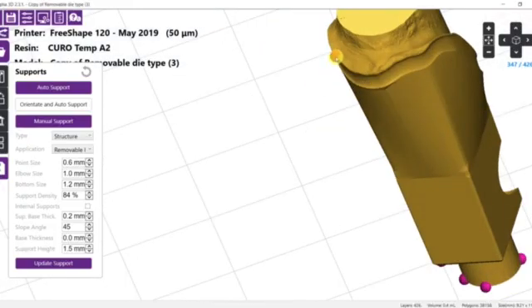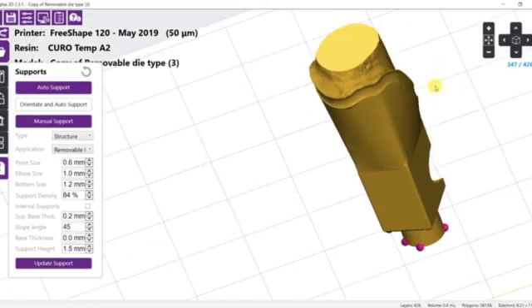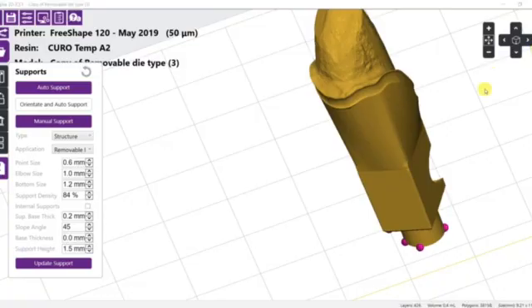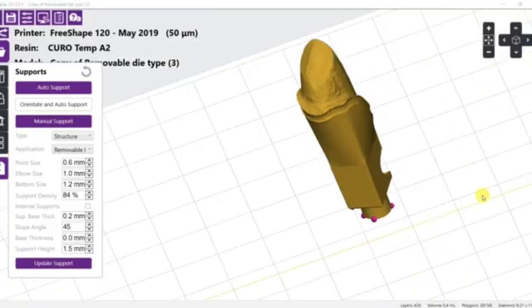To remove the support, simply click the pink point on the piece.